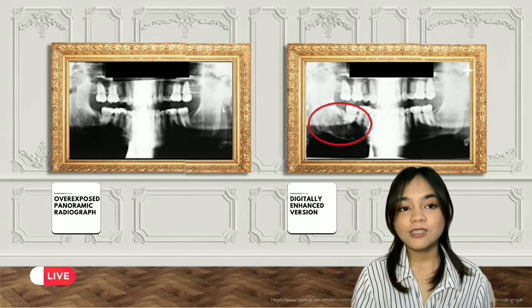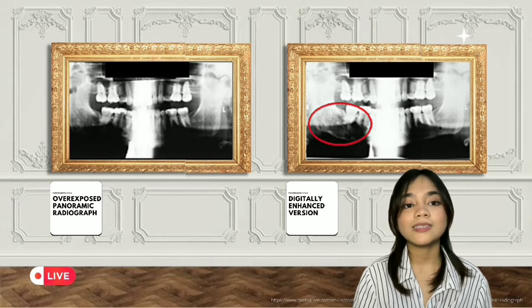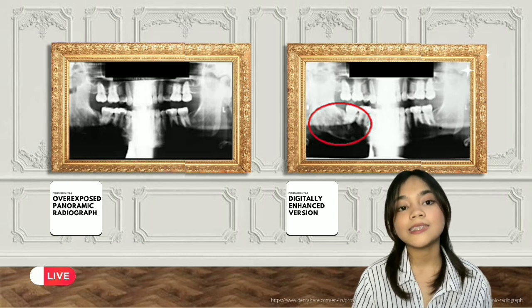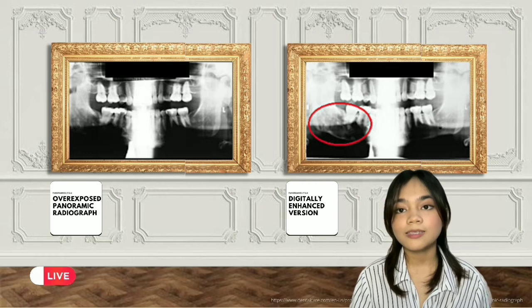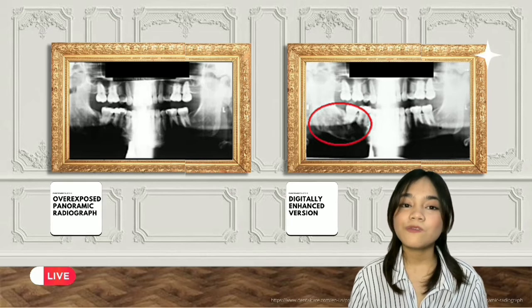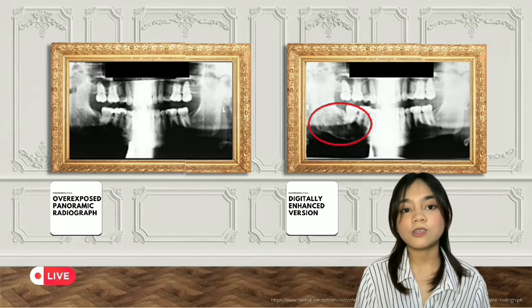In addition to this, we have to assess the exposure of the image. We have to have an adequate exposure, which implies adequate density and contrast, which will help us to easily recognize anatomic features. Excessive or inadequate density can lead to failure to detect features such as erupted or impacted teeth and even pathology. So here on our left, we have an overexposed panoramic radiograph. When we have an overexposed image, it can lead to failure to detect pathologic features.